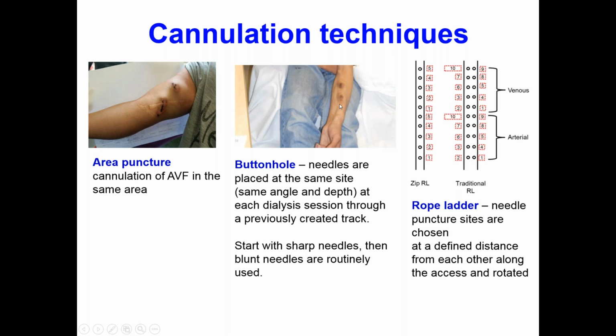So if you have a patient who, for example, may have eczema or have some skin disease, or where you're concerned that their overall hygiene is not that perfect, then you have to very carefully consider the risks of sepsis and infections versus the risk of benefit from a buttonhole. In most patients, we recommend buttonhole technique in my center, except those where you're concerned about sepsis.